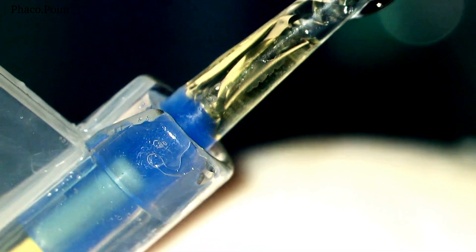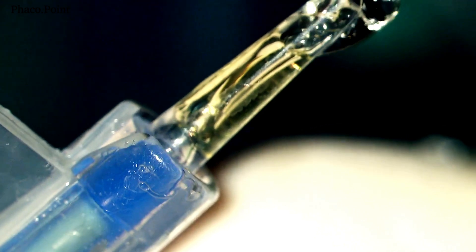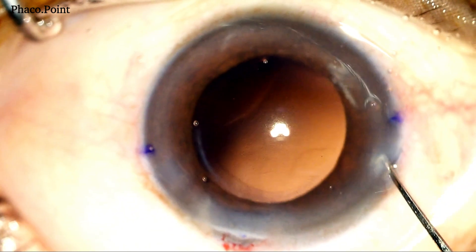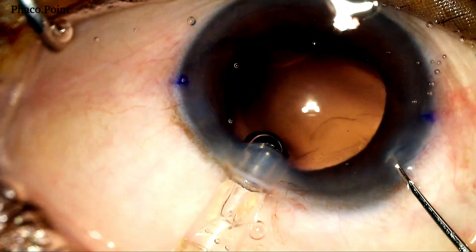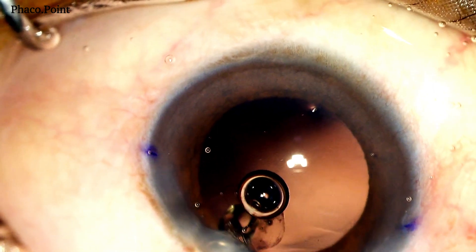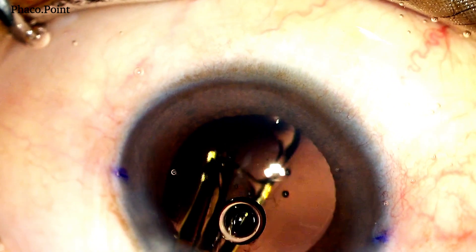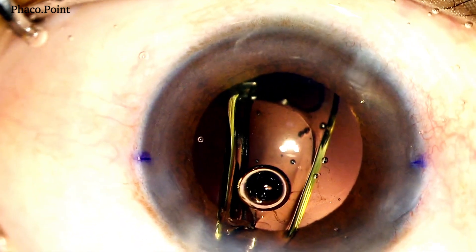Having reached the anterior end, the piston is drawn backwards to ensure that the trailing haptic or any part of the optic is not trapped between the cartridge and the plunger. We are now ready for the toric IOL implantation. I use the Sinski hook to afford some counterpressure during the IOL insertion. The tip of the cartridge is introduced within the wound, turned downwards, and in a careful and controlled manner, the IOL is slowly injected such that the leading haptic goes below the inferior axis within the capsular bag.